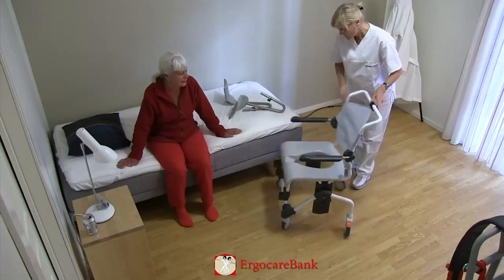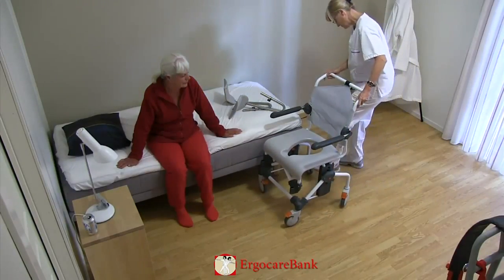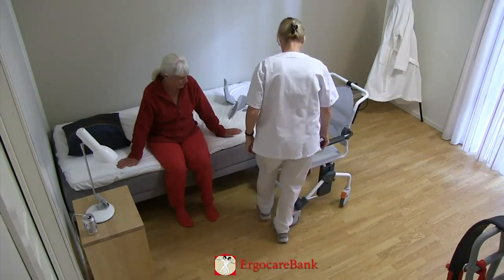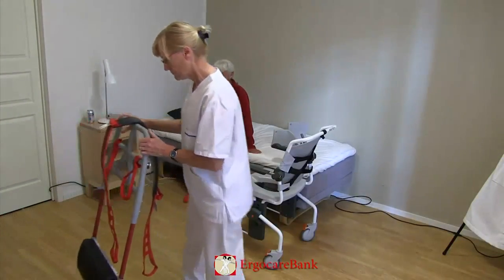The shower chair is brought alongside the bed. The foot rests are taken off and the brakes of the chair are put on. The Raizer is brought in close to the bed.